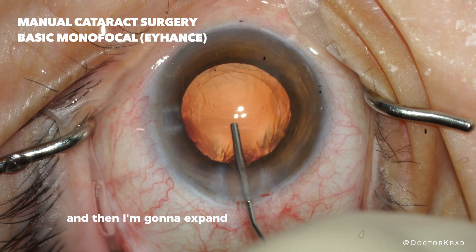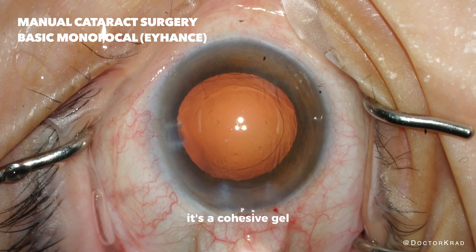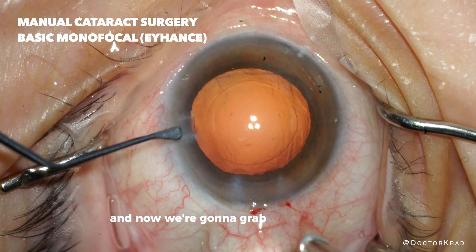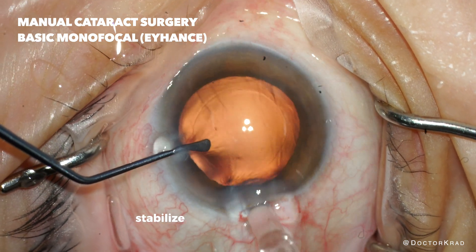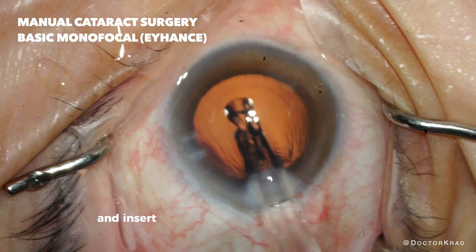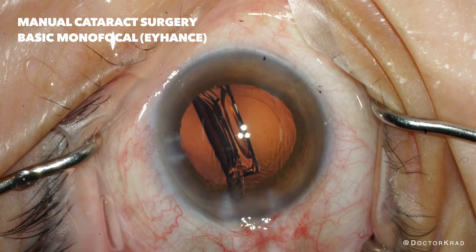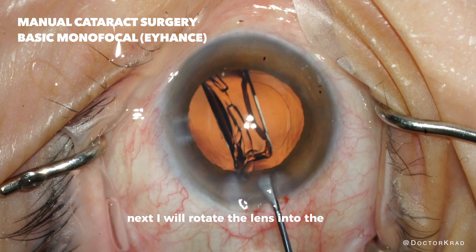Then I'm going to expand the capsular bag with more gel — it's a cohesive gel, expanding that. Now we're going to grab the lens implant, stabilize the eye with the left hand, and insert the lens implant into the capsular bag. Next I will rotate the lens into the bag.